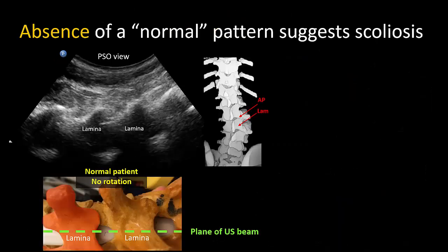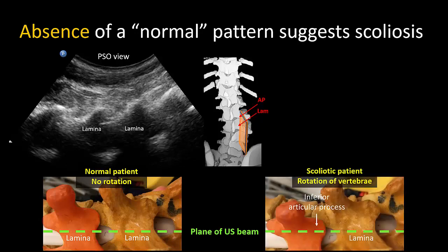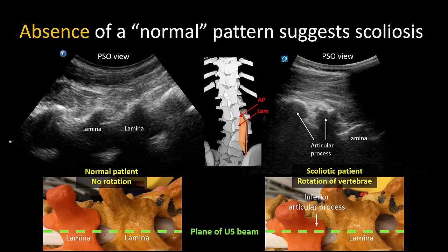Note that the classic repeating sawtooth pattern of the parasagittal oblique view may not be seen in scoliosis because of the rotation of the spine. When the vertebrae rotate on each other, the ultrasound beam may now cut through an articular process rather than the lamina. This will be evident by a rounded shadow rather than the sawtooth-shaped one, and is yet another clue that scoliosis is present. This underscores the importance of learning to recognize normal anatomy.